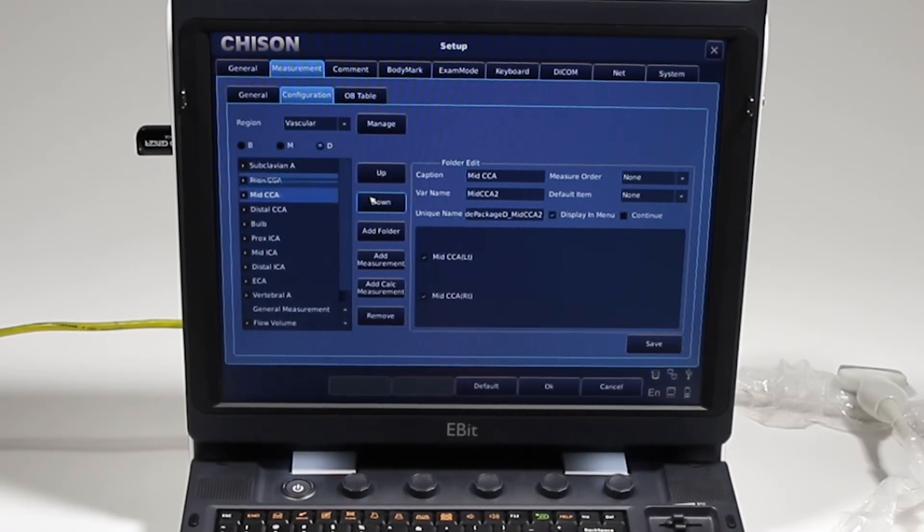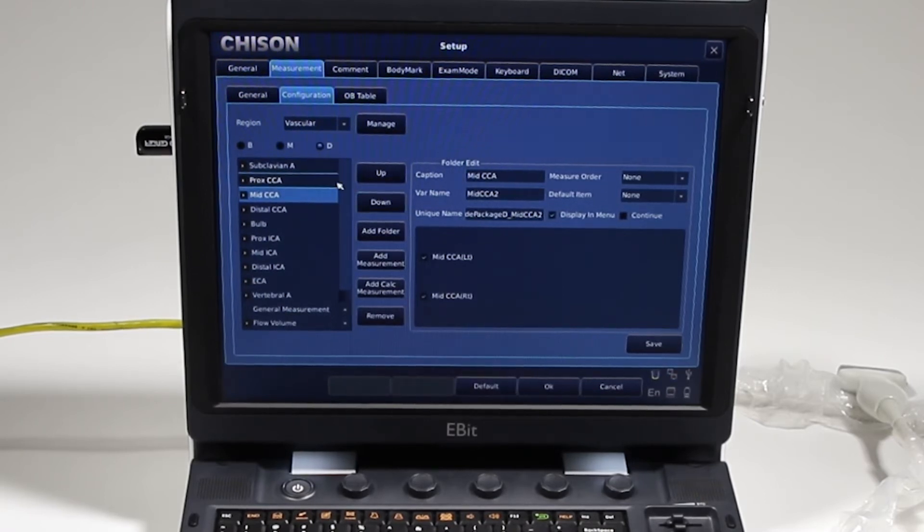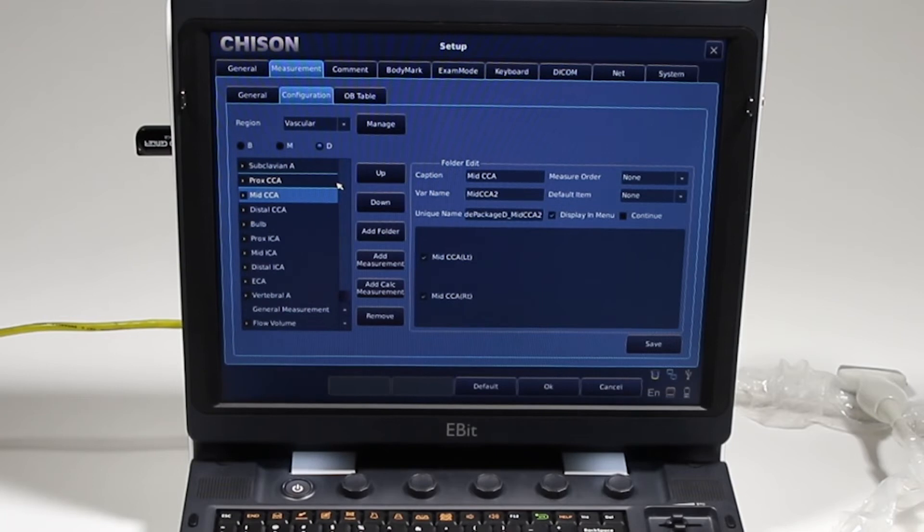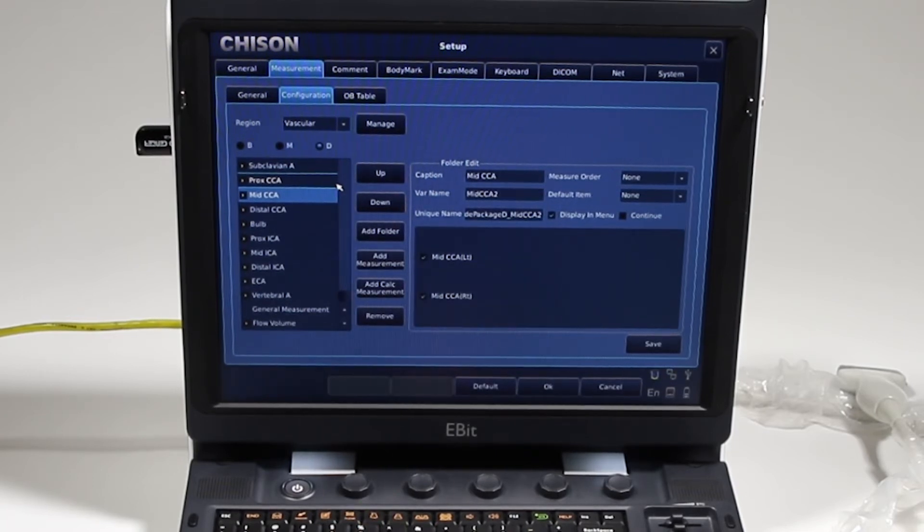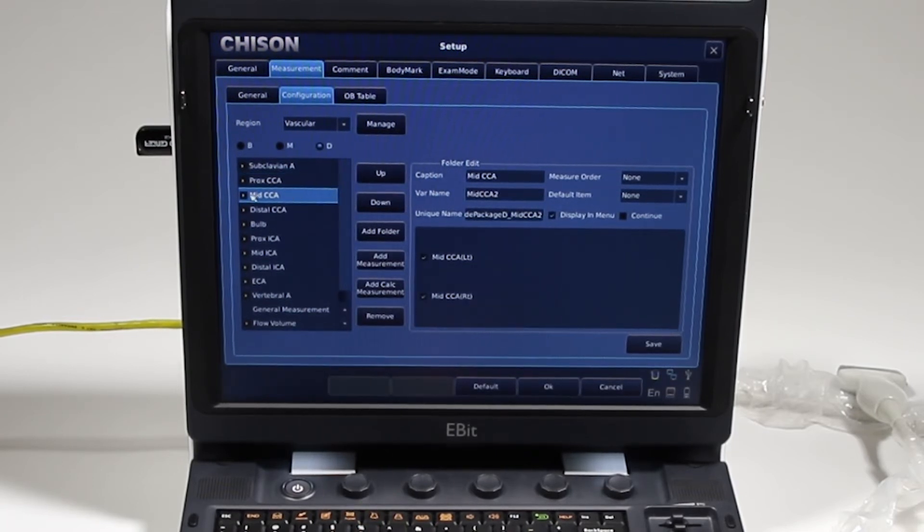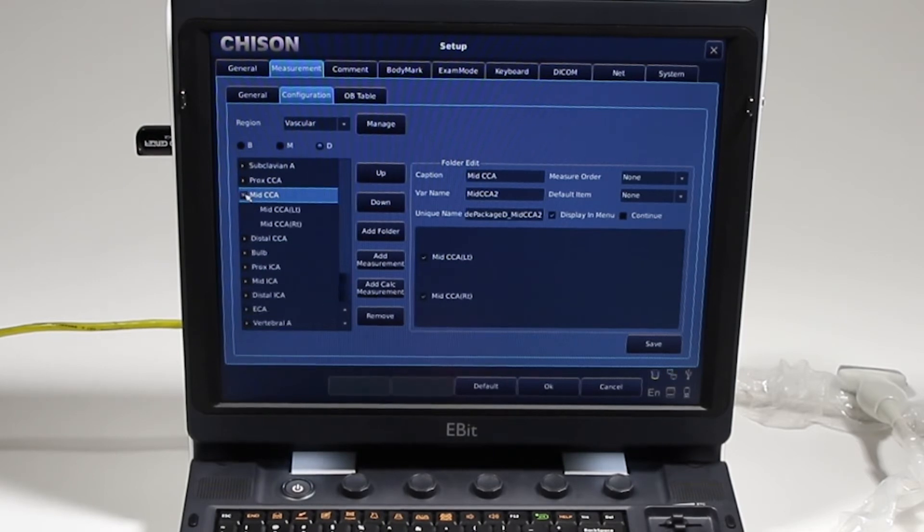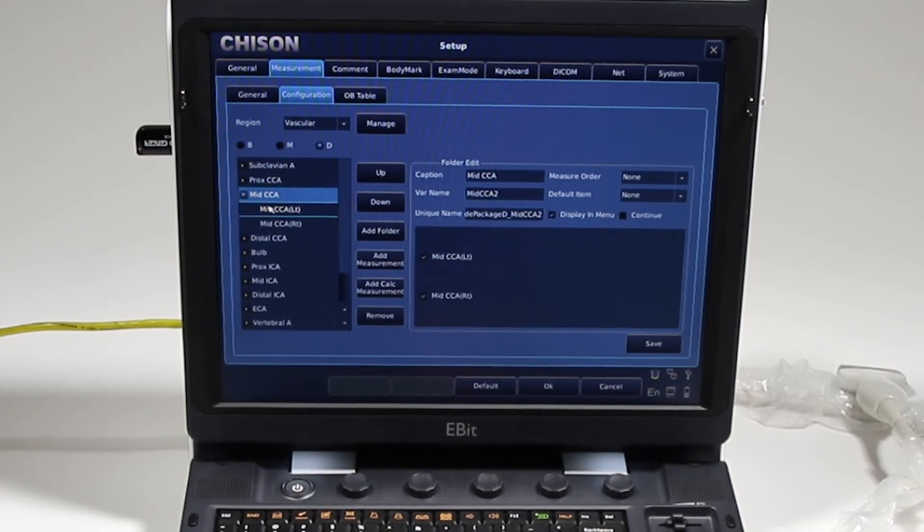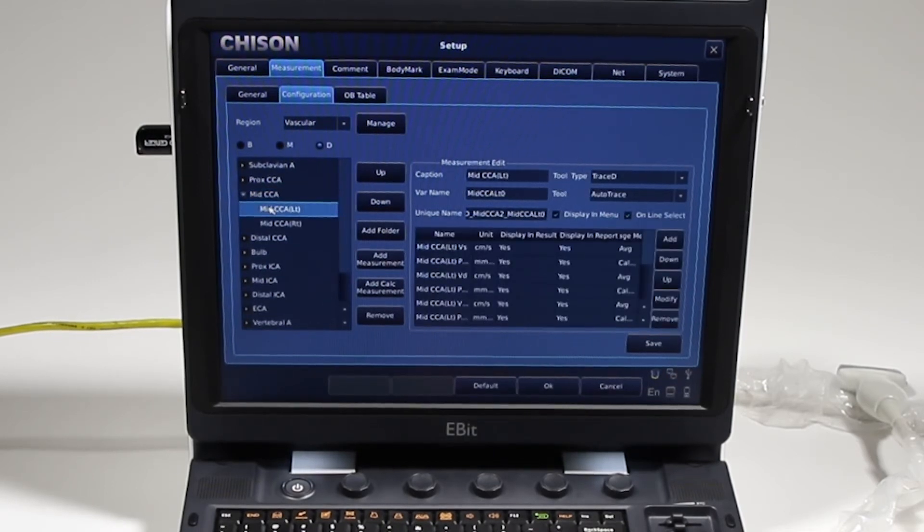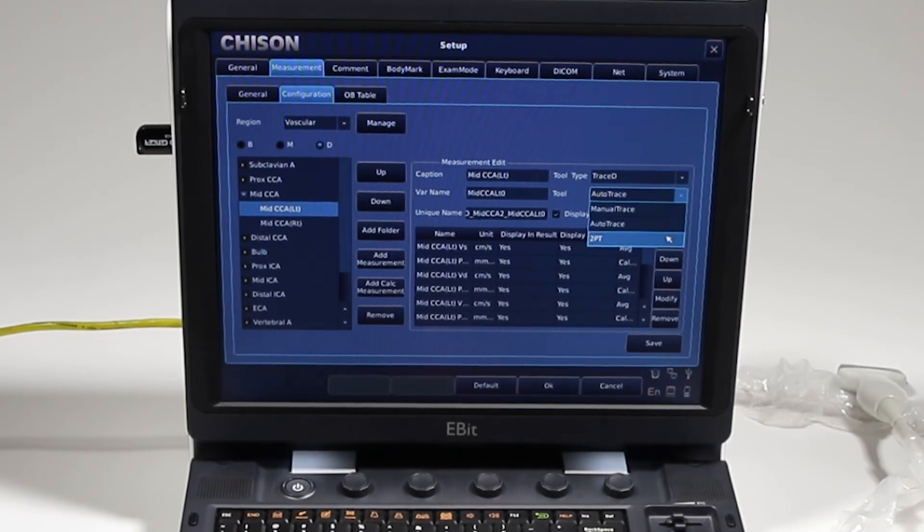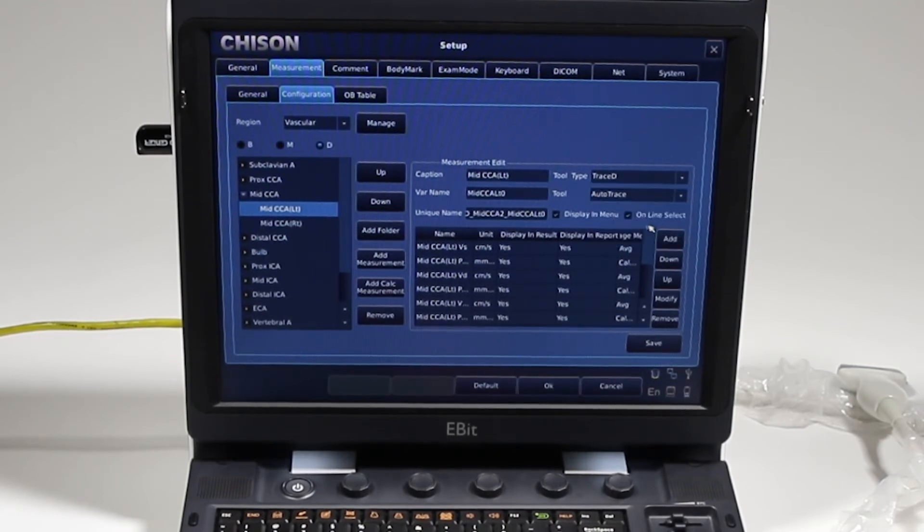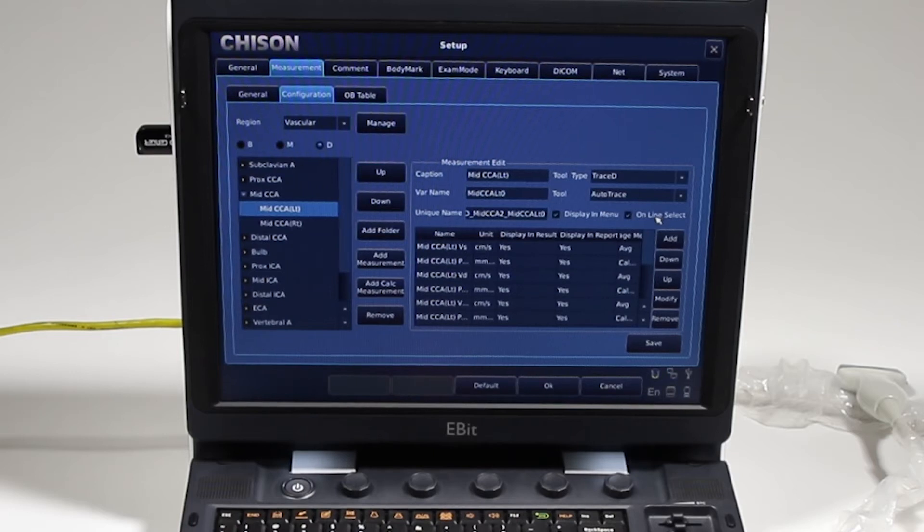So if I want mid common carotid to appear at the top, I can go ahead and do that. And when I click OK, every time I hit from Doppler mode in a vascular, each time I hit the calc, that is going to be what shows up. And then you can also hit this triangle here to scroll down. And note here is where you can also change it from auto trace to manual or a two-point measurement.